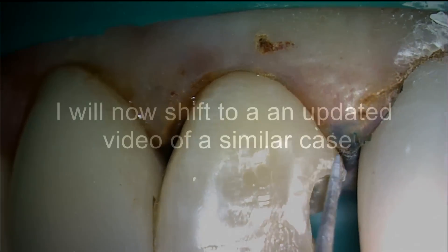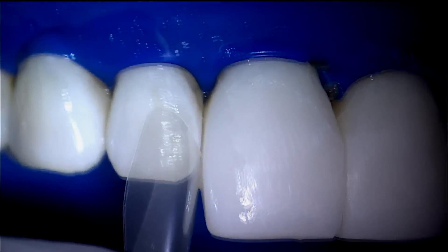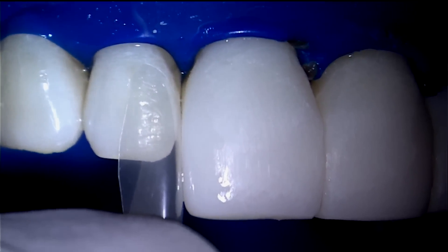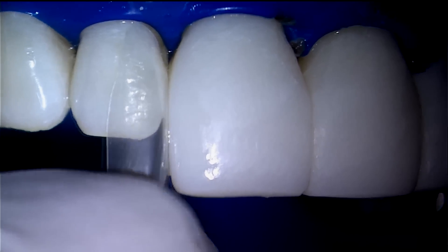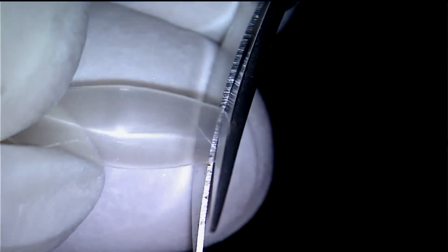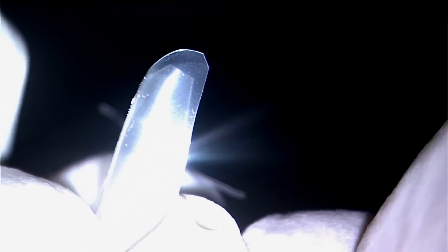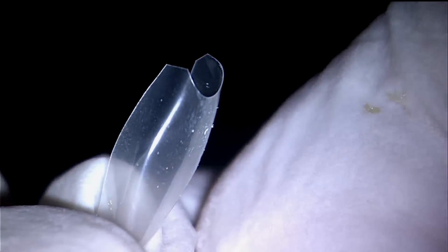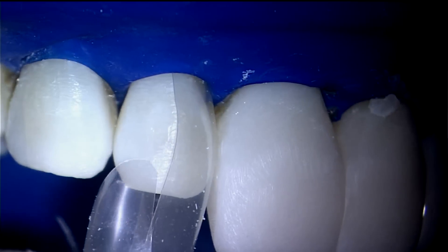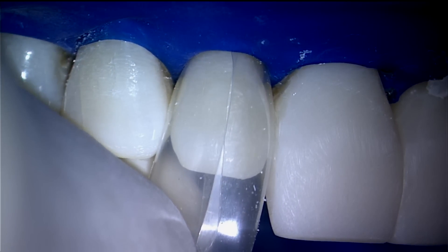We will now briefly shift to a newer case with updated matrixing and filling techniques. Notice the patent pending cervical notch of the BioClear 360 veneer matrix that corresponds to the patient's papilla. This allows full seating and an ideal seal with the matrix. Here I am trimming the palatal of the distal matrix, as the palatal zenith was shorter on this patient than the facial zenith and would not have allowed full seating. In these cases it is important to trim back the palatal portion of the matrix slightly.